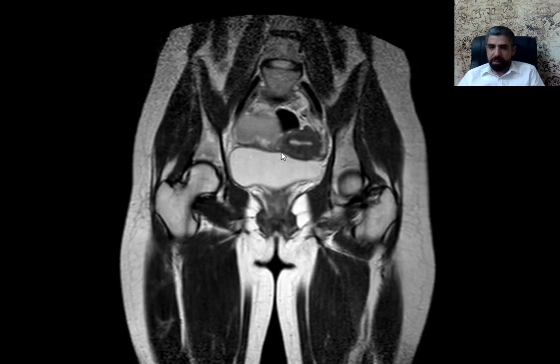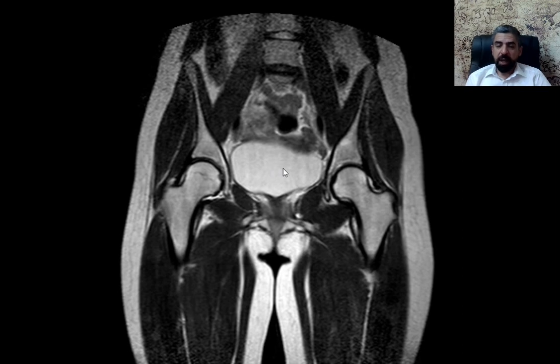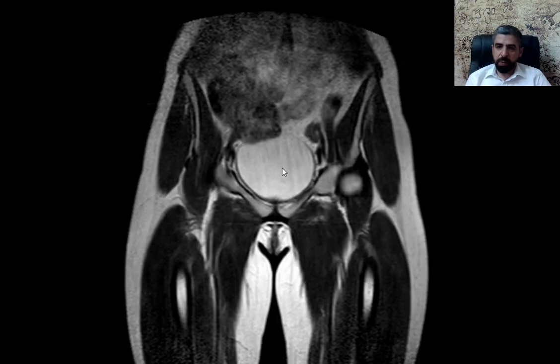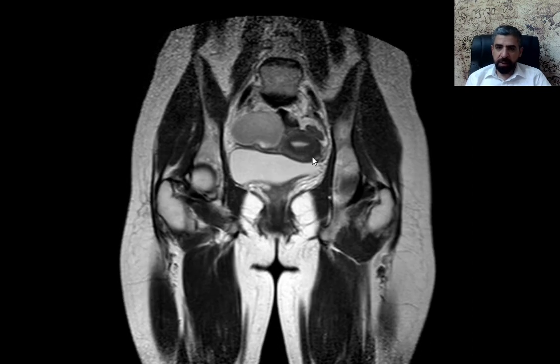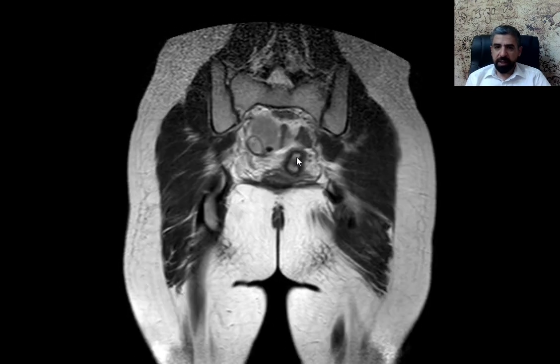We can say this is a T2-weighted image because you can see the urine in the urinary bladder — that's the urinary bladder — and urine and fluid are bright on T2-weighted images. We can see the endometrium, which is hyperintense or bright, followed by the junctional zone and the myometrium of the uterus, which appears basically normal.